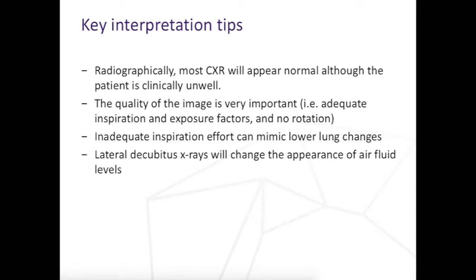These images can actually be quite good, but you need to make sure that you give yourself the best opportunity. So arms out of the way, making sure that the patient, if they can't lay flat or can't sit up, is fully on their side to not introduce another angle. If you are doing lateral decubitus, make sure the patient is fully on their side and you note which side is up because that does change how the air fluid appears.